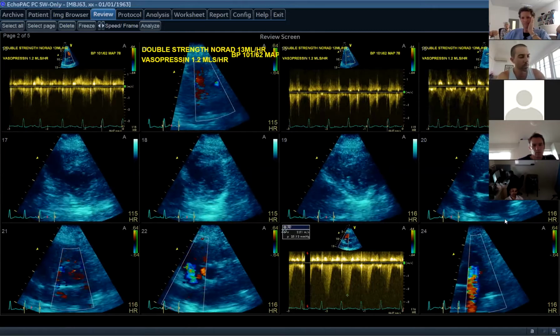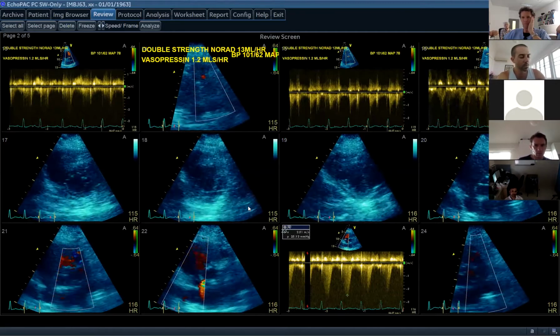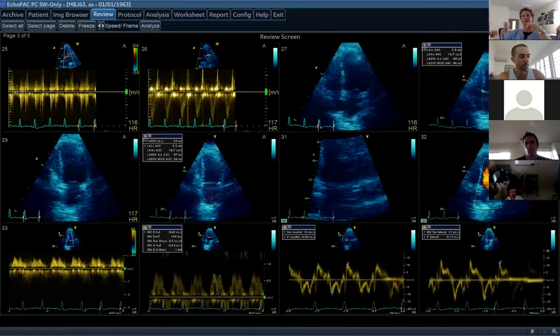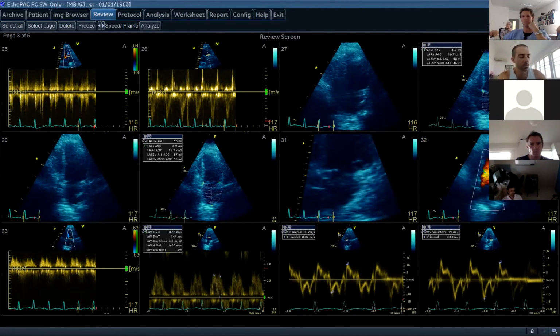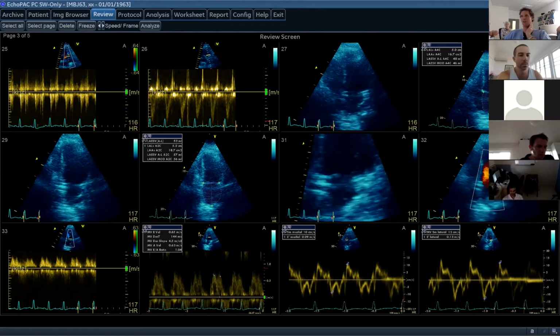But you mentioned whether it is acute versus chronic. Yeah. The chamber size, and if there is valvular regurgitation, then they are more likely to be chronic. Absolutely. I think you can have a few things that will point you in there. If you've got some form of bad LV systolic function, you by definition would have some form of LV diastolic dysfunction, and that would give you some form of dilated left atrium. Absolutely fair comment. I'll take that.